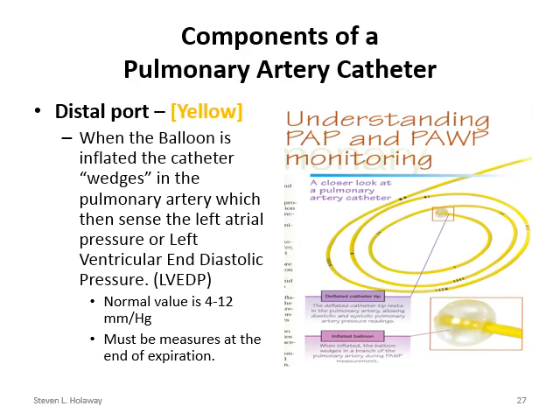We want to measure that at the very end of expiration of the patient. So they take a deep breath in, they exhale. Just as they end exhalation, that's when we want to look at that reading for that patient. Elevated wedge pressure can indicate left-sided heart failure, mitral stenosis or insufficiency, or pericardial tamponade. Again, low readings usually are related to fluid volume type issues.